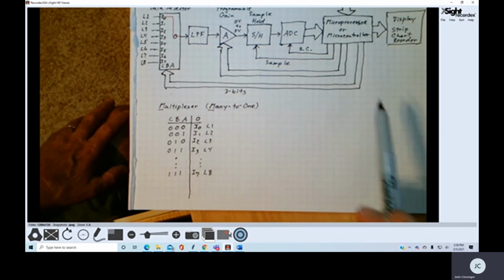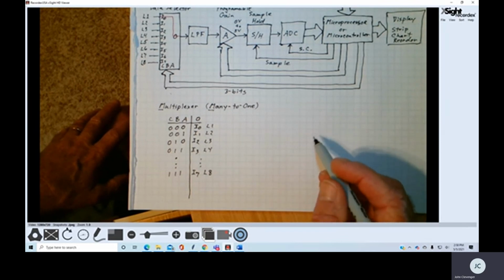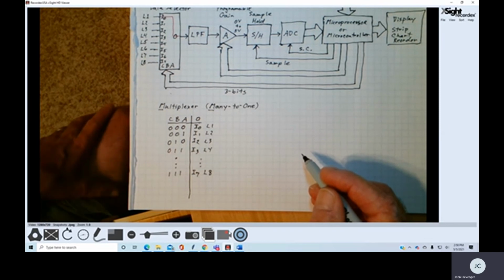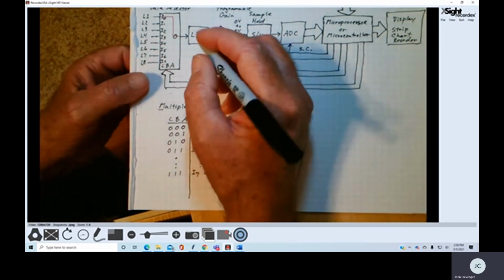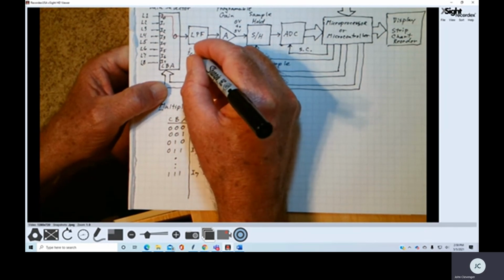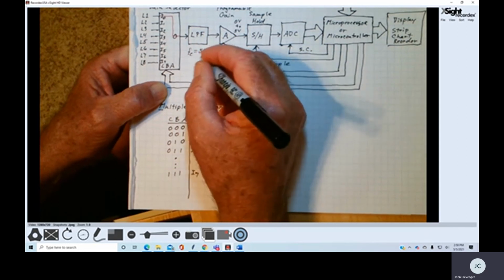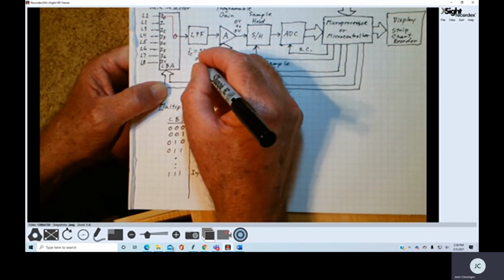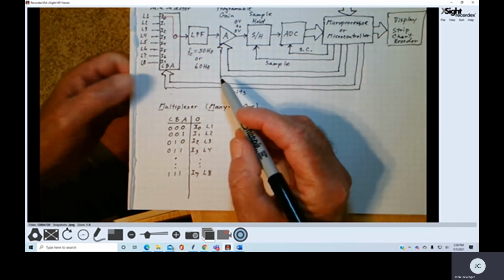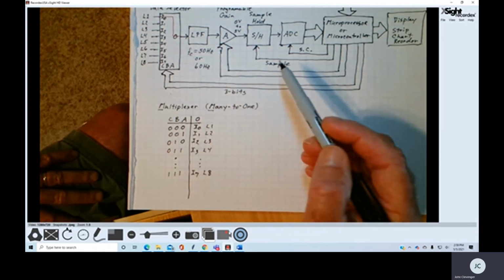So the next block, of course, is the low pass filter. We've talked about filters fairly extensively in a previous weekly unit. And again, with my low pass filter, I want to have a cutoff frequency that could either be 50 or 60 hertz, depending upon, well, I'm not sure what it depends on, but I'll say 60 hertz. Again, if we have our cutoff frequency at 60 hertz, my thought is that we're prone to get a lot of 60 hertz energy into the system.